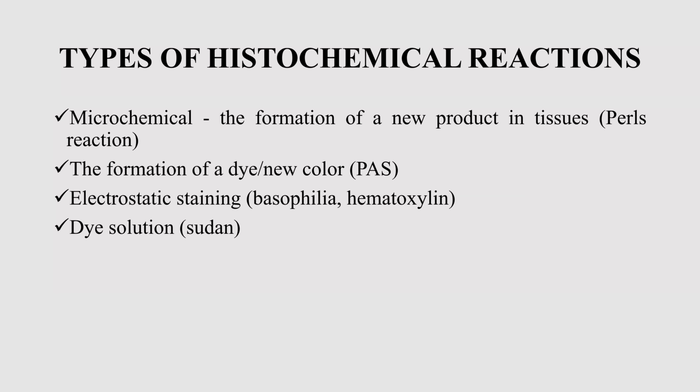The next type is formation of a new color. A typical representative is the periodic acid Schiff reaction. Due to this reaction, Schiff compounds form in tissues, which create a nice pink or reddish color.